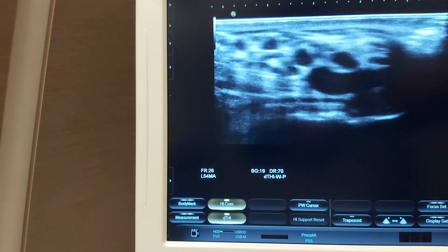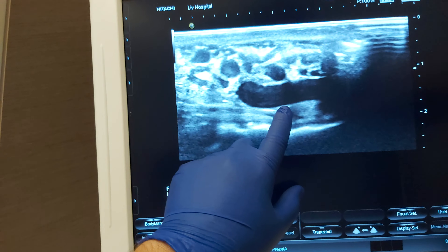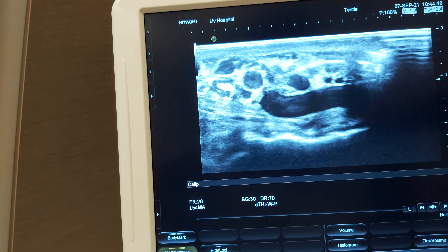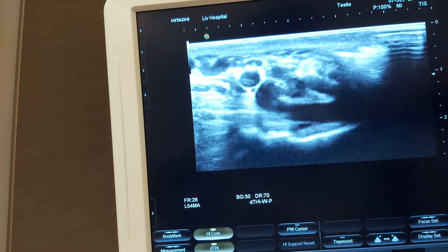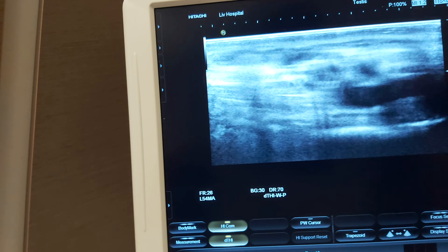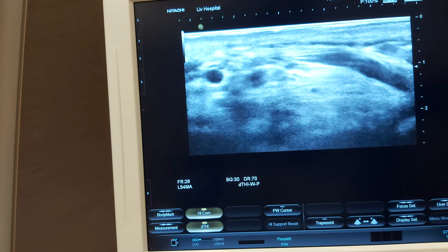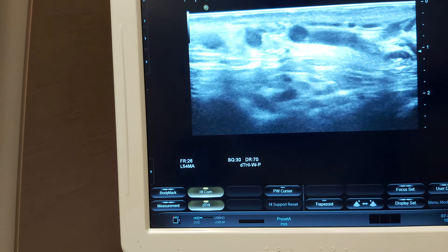Now we are looking — this is a very large vein. I don't want you to strain; you are just in a standing position. When we measure how large this vein is, it's 4.8 millimeters without straining, and it goes all around the testicle. Our procedure is mainly taking out these large veins — we don't want any remaining vein around the testicle; visible veins must go.